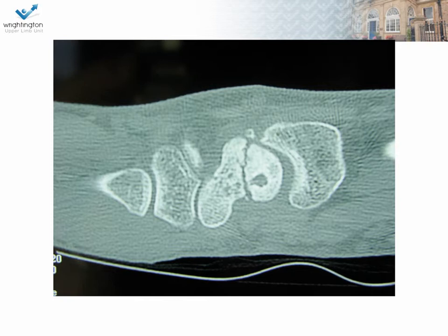This is a CT scan of a gentleman's right wrist. Can you tell me what you can see, what the abnormality is? That's right, it's a scaphoid non-union. Tell me about the features of this non-union. There is a humpback deformity, cyst formation, and the edges are very sclerotic.